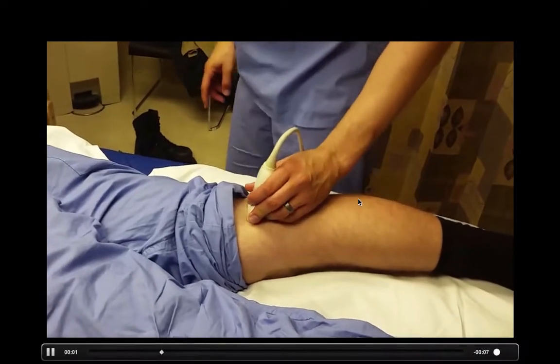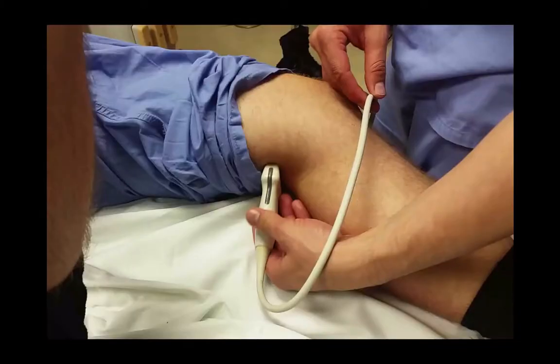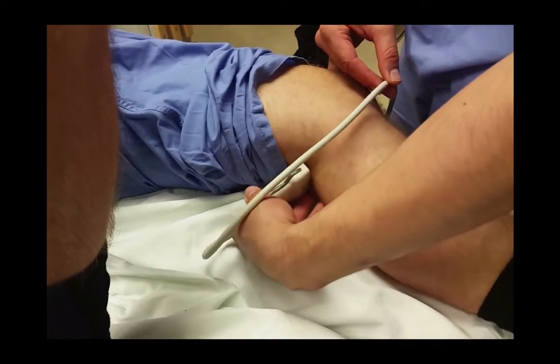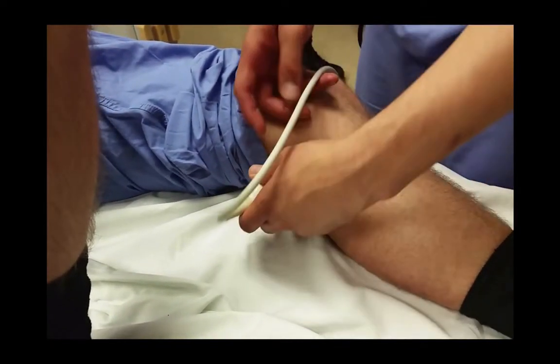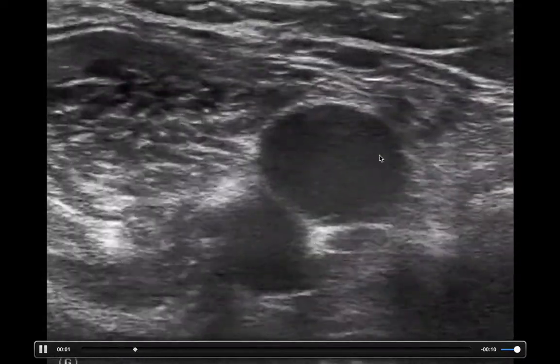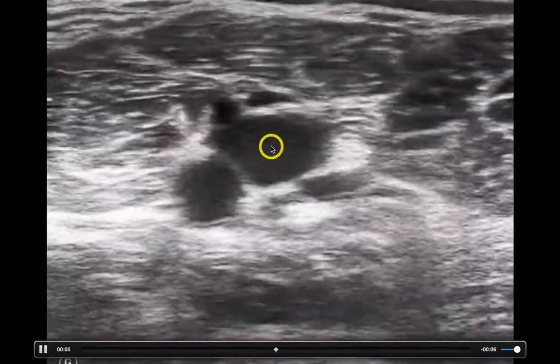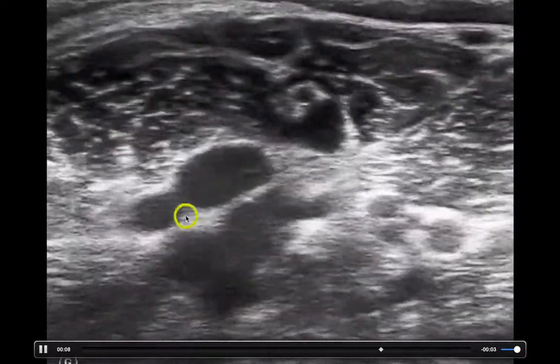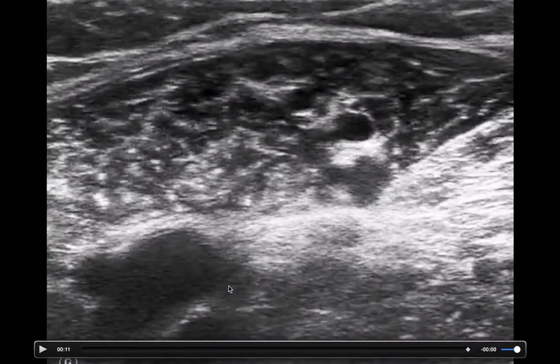It's the same thing — you find that vein, you compress, you move a centimeter down, you try to compress again. If you can't get them to lay prone, you can always frog-leg their leg out — bring the knee out laterally — and you can do the same technique there. Here's the anatomy: we have the popliteal vein and the artery, the vein pops on top in the popliteal area, so it's always going to be more superficial relative to the artery. Then right there, you can see it branches off into the calf veins and arteries.